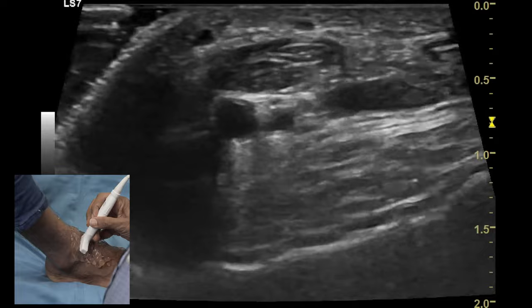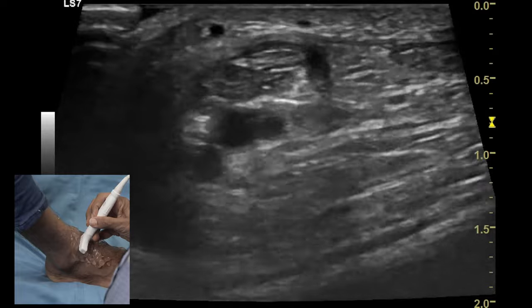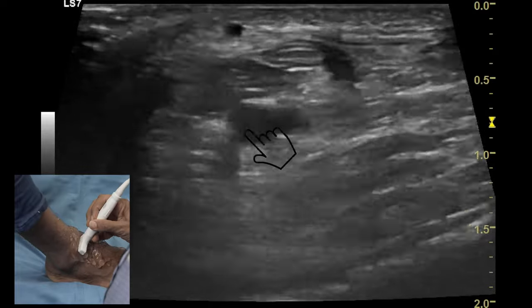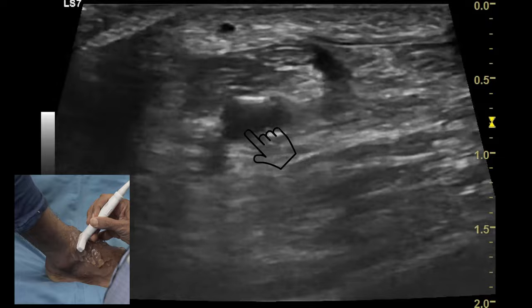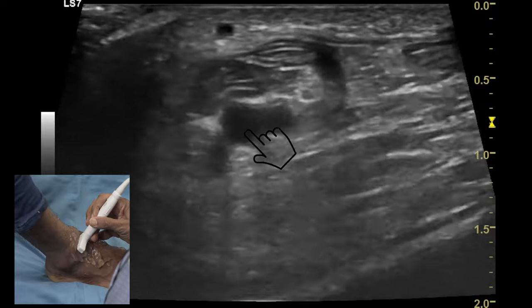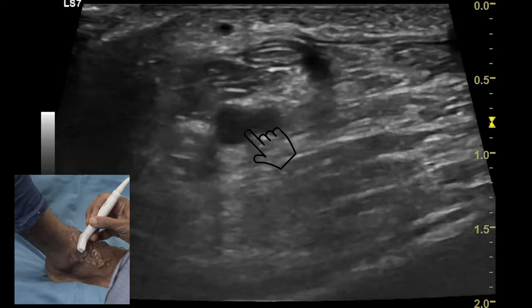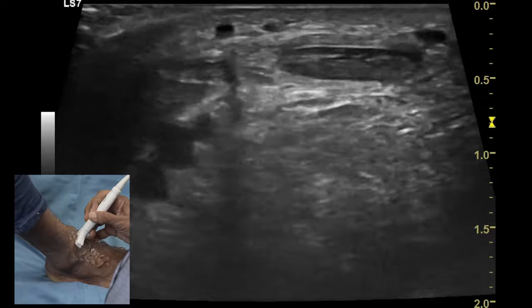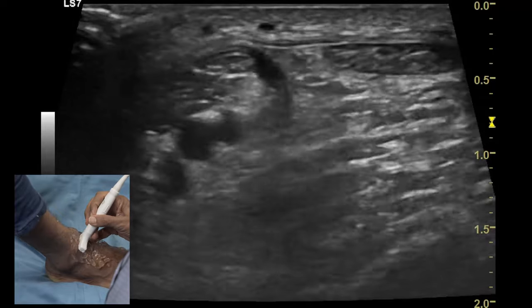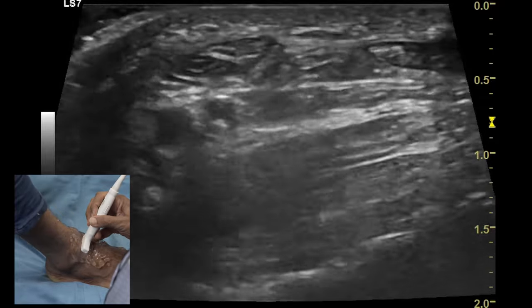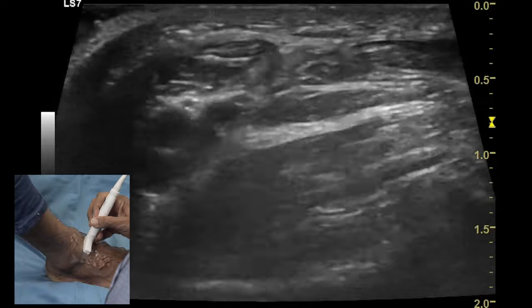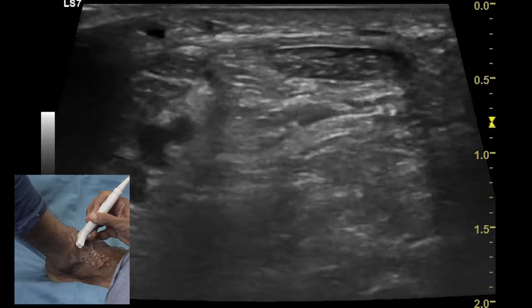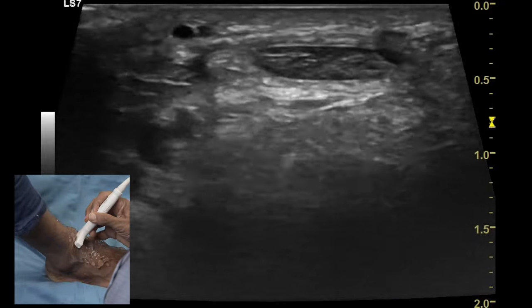After the extensor hallucis longus is examined, we need to move more laterally. Between the extensor hallucis longus and the extensor digitorum one can see the neurovascular structure which consists of the anterior tibial artery, the vein, and the deep peroneal nerve. By moving the transducer from superior to inferior, all three structures can be evaluated very well.